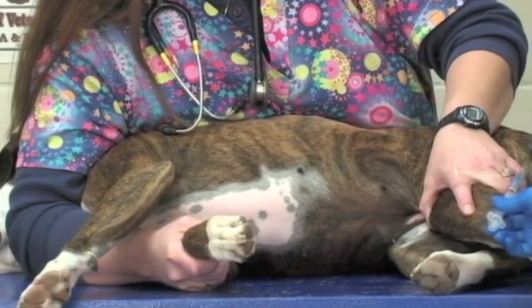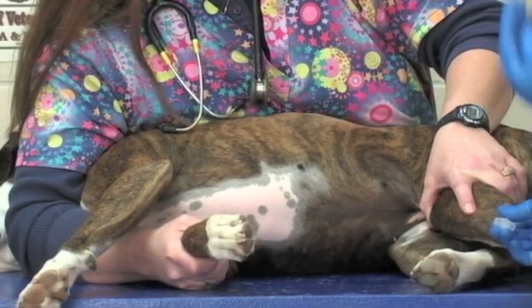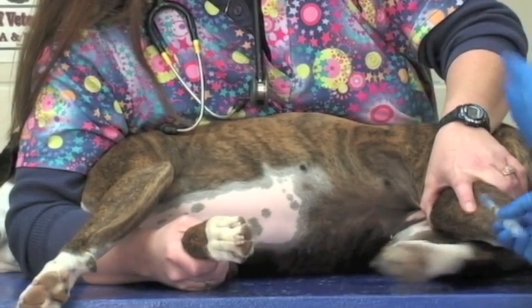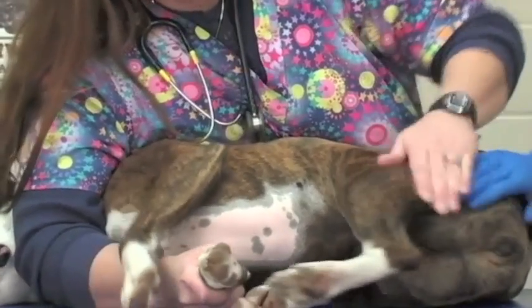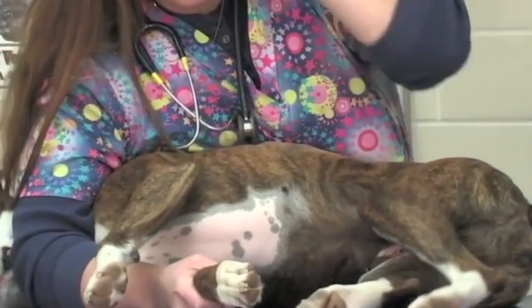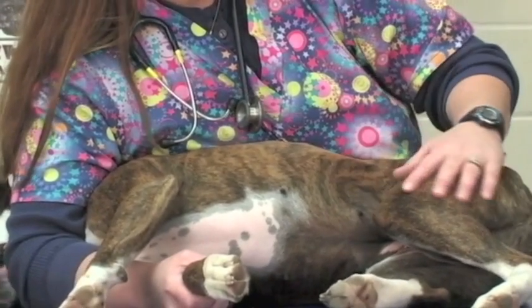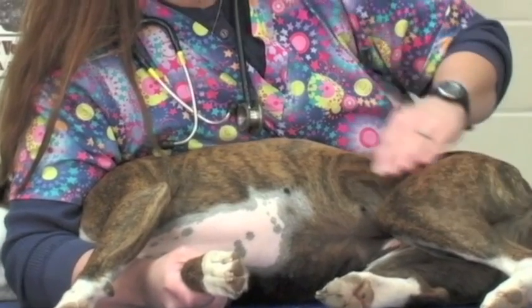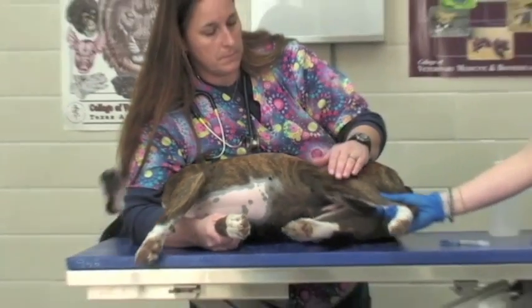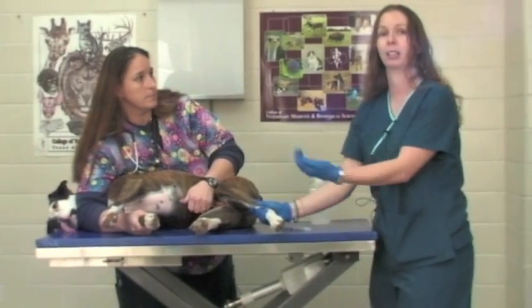Just make sure that your needle and syringe are parallel with the vessel and then enter the vessel at a 30 degree angle with the bevel pointing up. Obtain your blood. Some patients are not quite as easy to place in lateral recumbency — if they struggle, their blood pressure goes up because they're anxious and nervous. If that happens while you're drawing blood, those platelets and clotting factors may not get to the needle hole fast enough and blood may leak out, resulting in a hematoma.